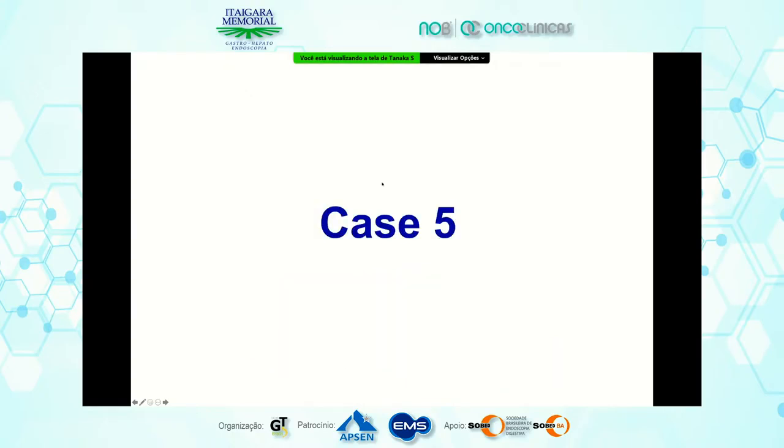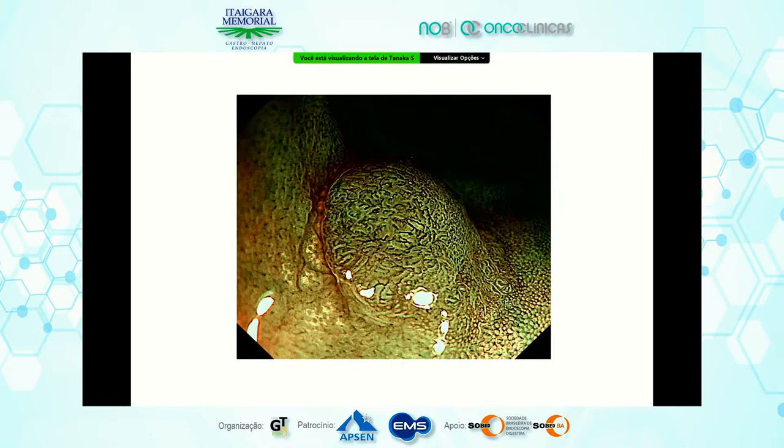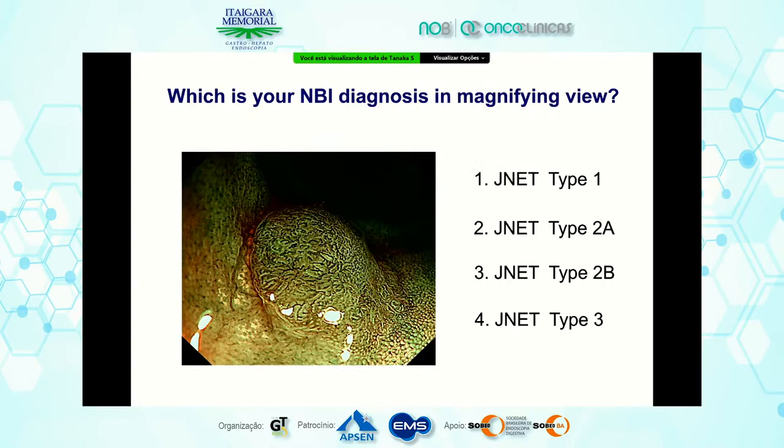Case 5. This is a very tiny polyp. This is an NBI magnifying view. Please vote.